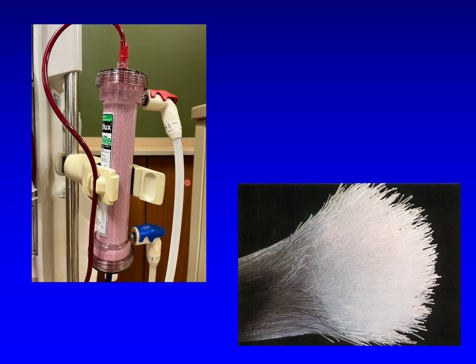However, the other concern in treating patients whose kidneys don't work is that you not only have to get rid of waste products like BUN and creatinine, but you also need to remove volume. The way this is accomplished is via ultrafiltration and convection.